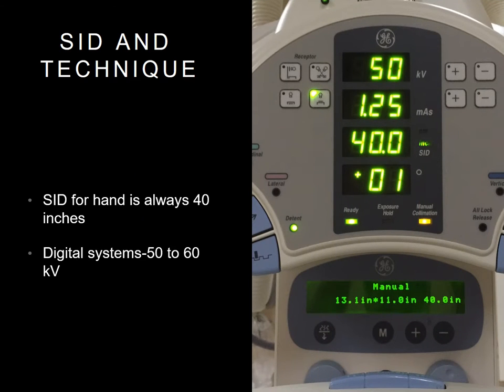Here's an example of the standard SID and technique for a hand X-ray in a digital room.